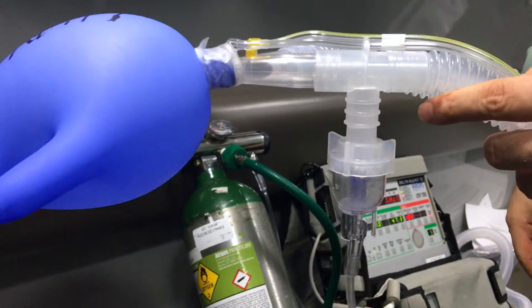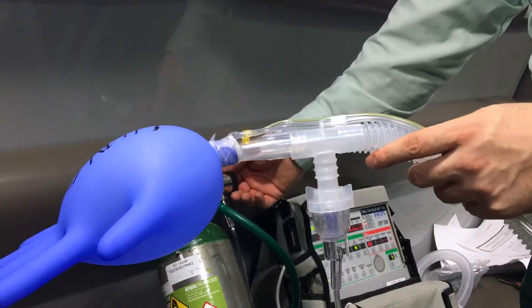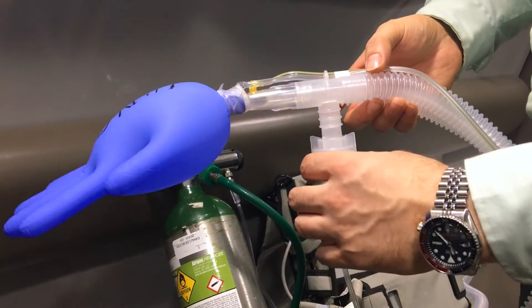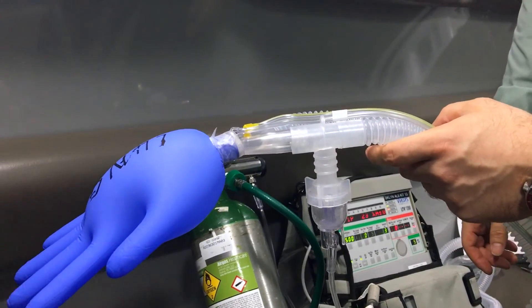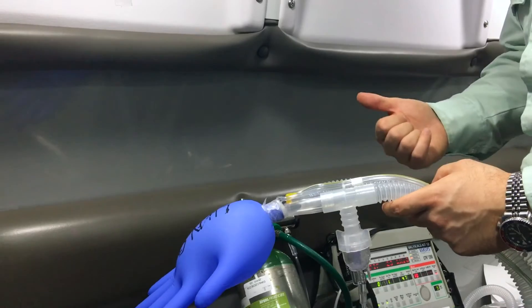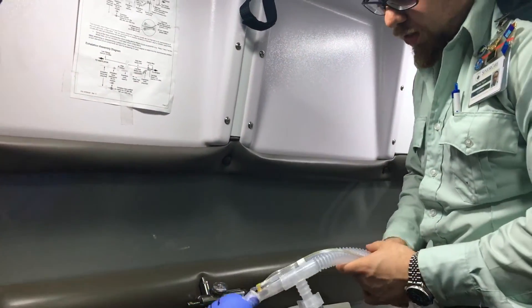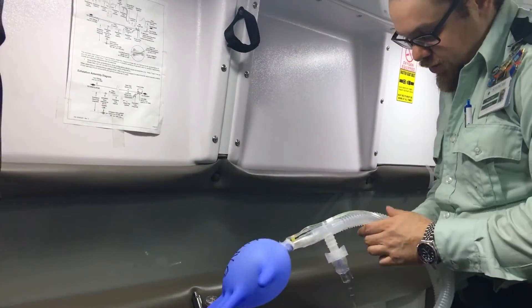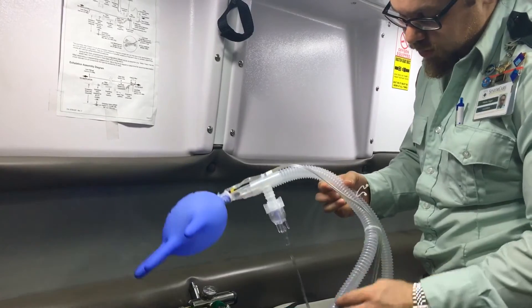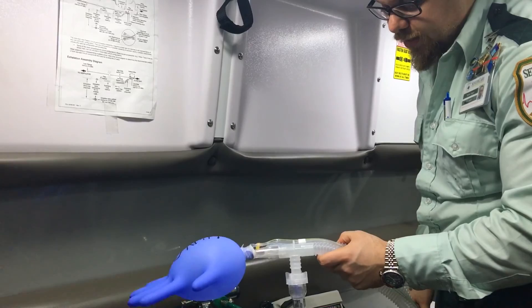If you're going to need to give additional treatments, you'll obviously turn this off, put your albuterol and ipratropium in, reconnect it, and turn it on. Auscultate the patient's lung sounds and listen for improvement of wheezing. Obviously monitor your SpO2, your EtCO2, and observe how the patient is doing. So just again — inline nebulization through the inspiratory limb, and the patient is getting the appropriate treatments.